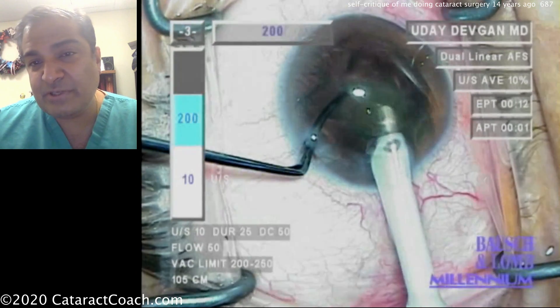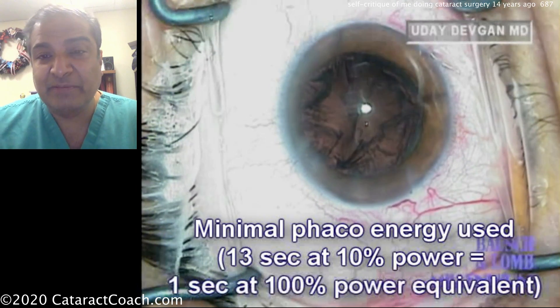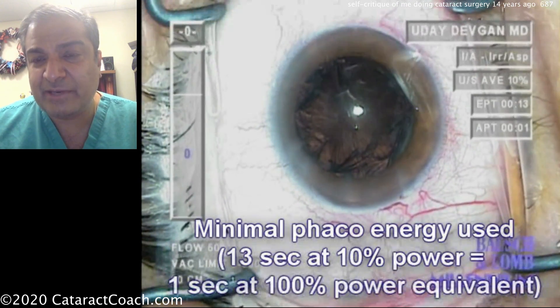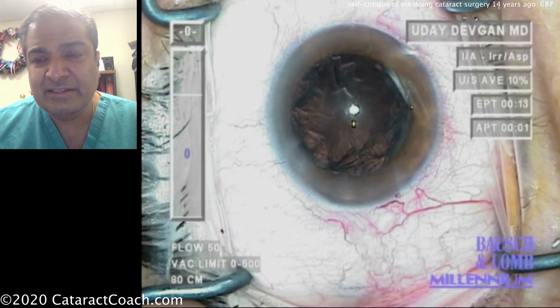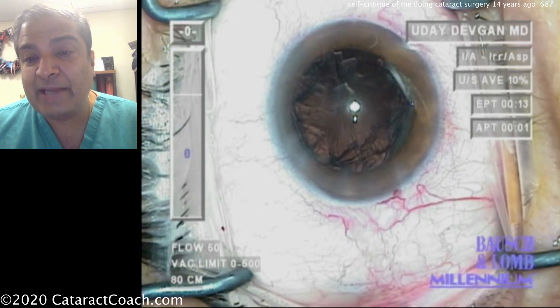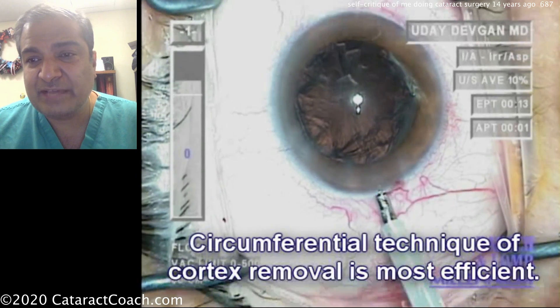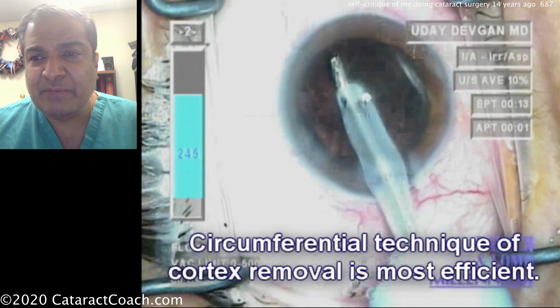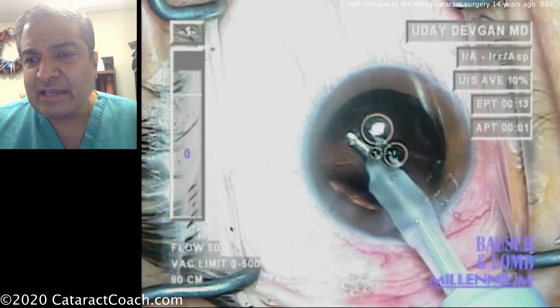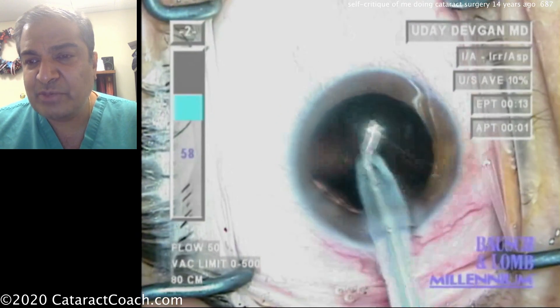For a video that's 14 years old it looks quite reasonable. This older phaco machine is no longer being made, and you can see with the power modulations very little phaco energy is placed inside the eye, so the patient will certainly have a clear cornea the next day. You can see that is certainly a wider incision than we're used to doing now. Cortex removal using these larger bore instruments, cleaning up the capsule, doing a little capsule polishing — it looks pretty reasonable.